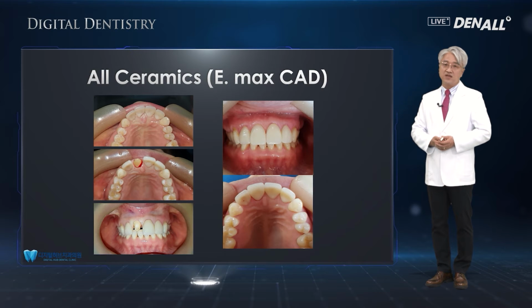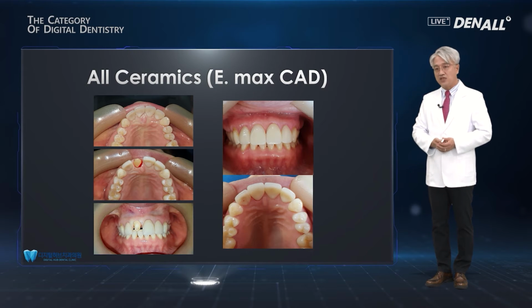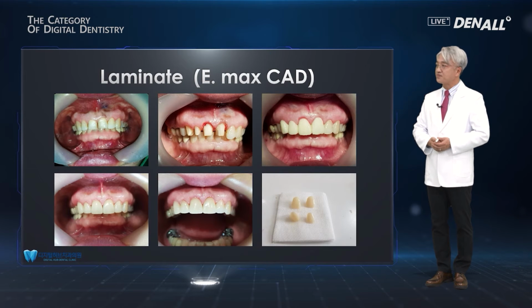In terms of aesthetics on the anterior side, Emax or first generation all ceramics or second generation all ceramics, I think aesthetically is the best. In terms of the satisfaction of the patients, this is also the highest.